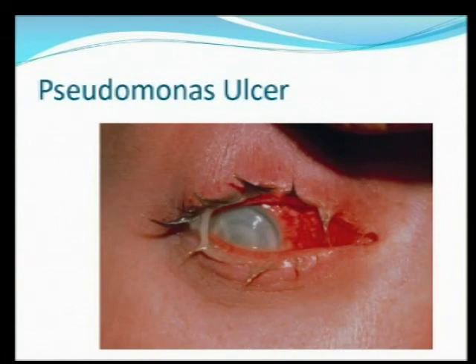We talked just a minute ago about the soft contact lens being a barrier protecting the eye, but it also will take away your natural warning system. Generally, if you had an ulcer developing and the contact lens wasn't in there, you would be in so much pain you would rush to the emergency room. But in her case, because the soft lens was working like a bandage on the eye, she wasn't aware of the full extent of what was going on with her eye until it looked ridiculous the next day.